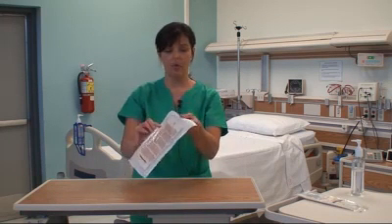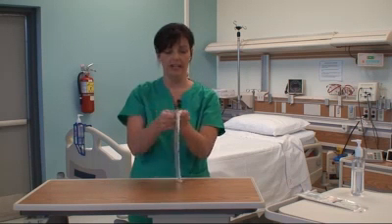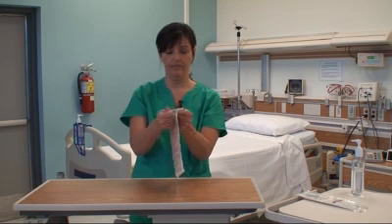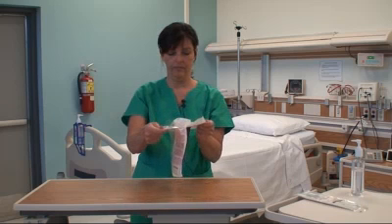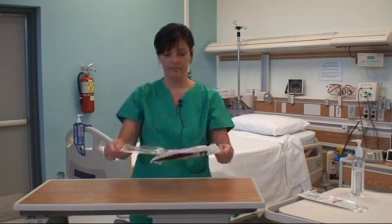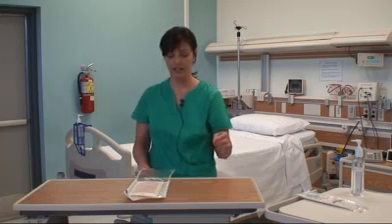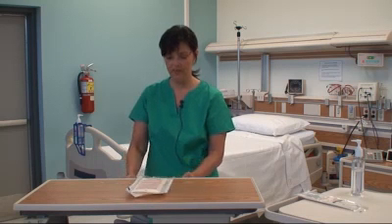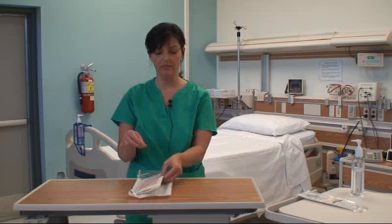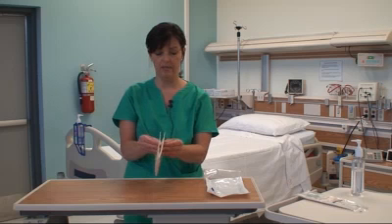Next, I'm going to open the packaging — this instructs me to peel downward. It's important not to touch the inside of the packaging. I have it open this way, and now I'm going to open up the packaging on my table.